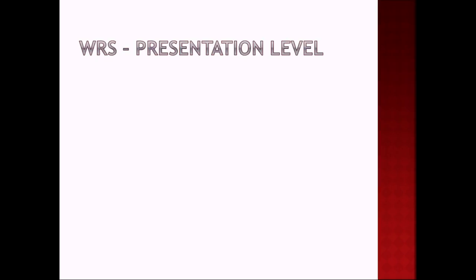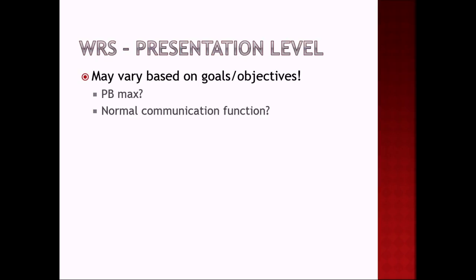So something suprathreshold should always be correct. And that can be a good guiding principle if you're unsure of what response to take in terms of threshold value.